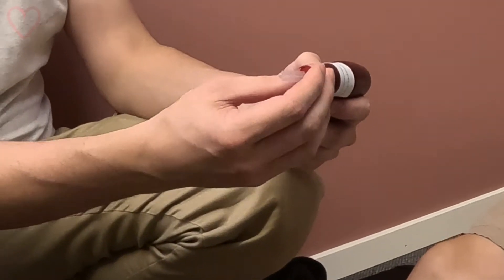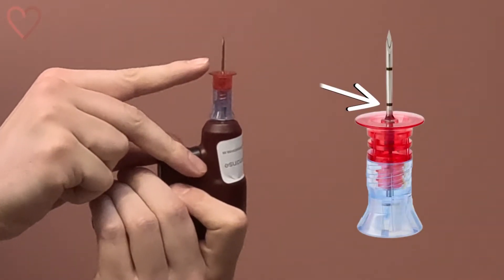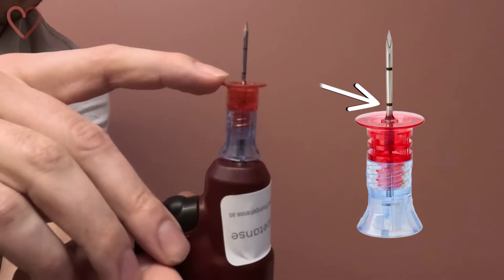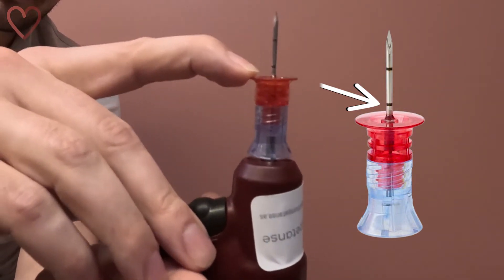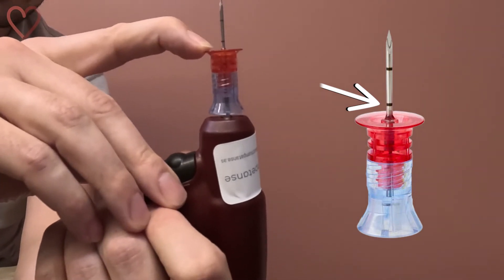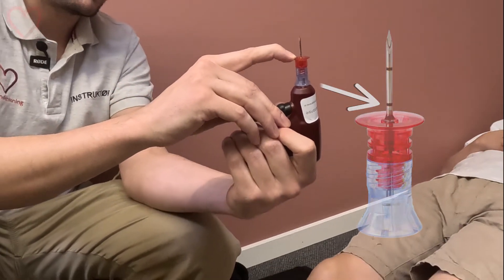The needle is magnetically secured to the drill. Remove the protective cap and you'll see two black centimeter markings. The last one, the five millimeter mark, must remain visible when the needle is inserted through the skin and rests on the tibia. This ensures that you're going deep enough. If you can't see that mark, switch to a longer needle.